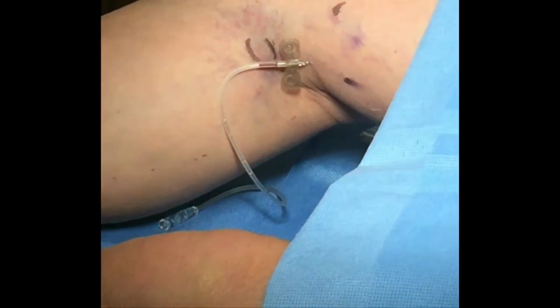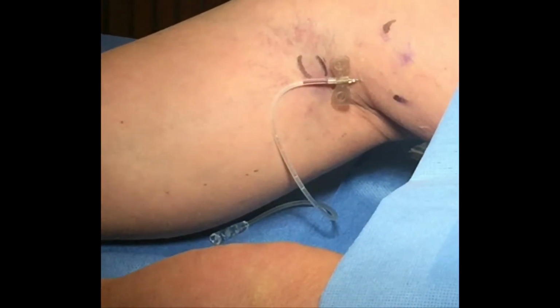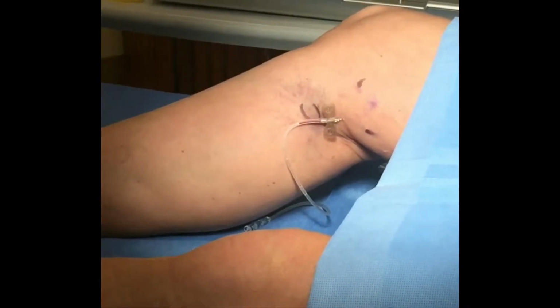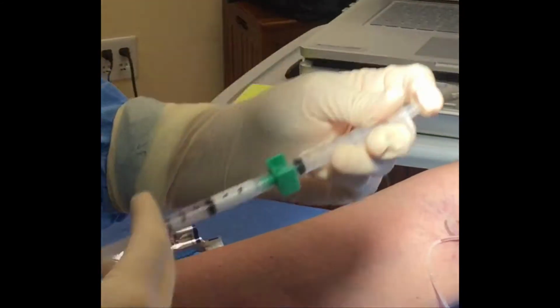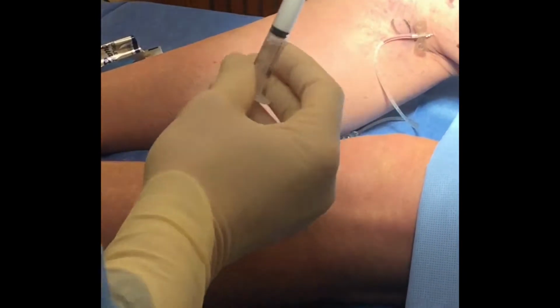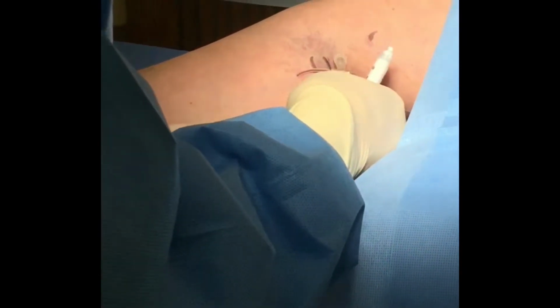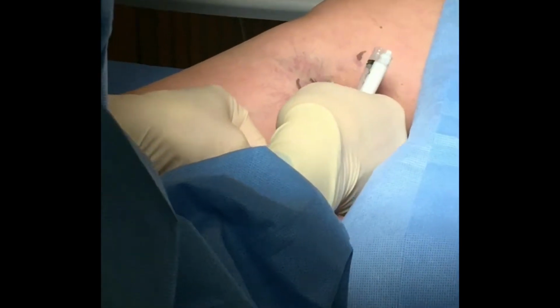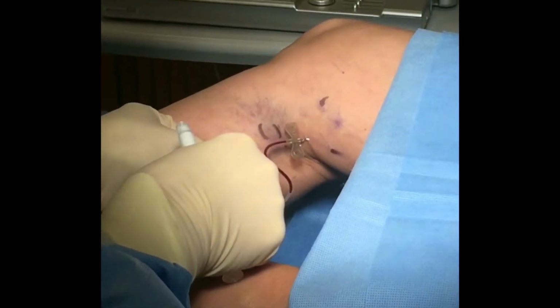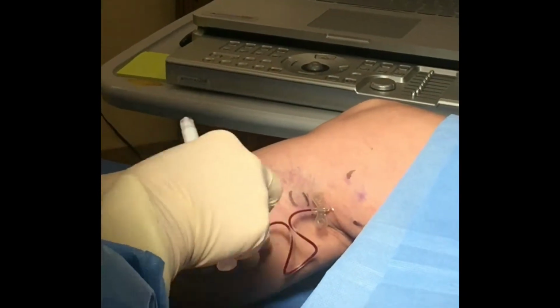So you can see we got into the vein. You can see blood coming back in the hub. Now we're going to mix our foam. And the nice thing about this foam is it really shows up beautifully on ultrasound. It'll show up as white speckles inside the vein. Blood coming back into the hub.